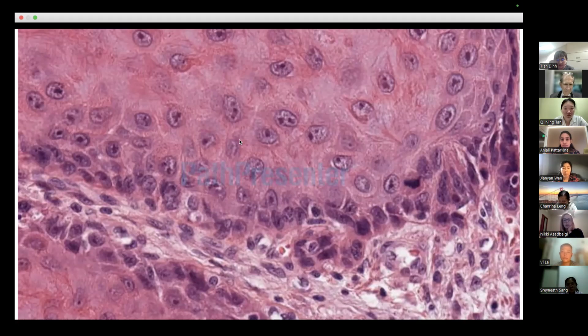If you're having a proliferation which has more cytoplasm compared to the nuclei, you're having a pink proliferation, but it doesn't have a lot of atypia. It's interesting because it's a very big proliferation. The borders are big, but usually if you're having a squamous cell carcinoma, you would want to have more atypia. Very good job. So I think we got the right answer.